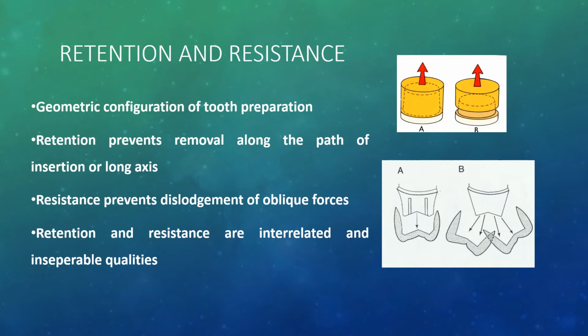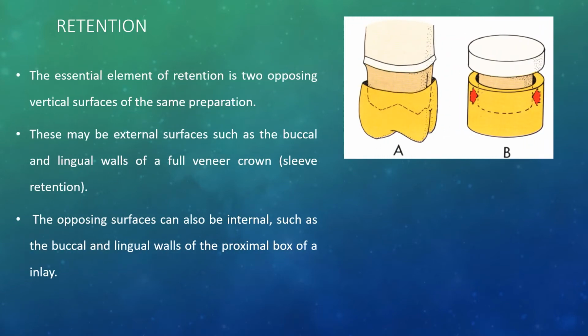Resistance and retention are both interrelated and inseparable, and both of them definitely play an important role in the success of your restoration. Retention is an essential element of two opposing vertical surfaces. So retention has more to do with the axial preparation.